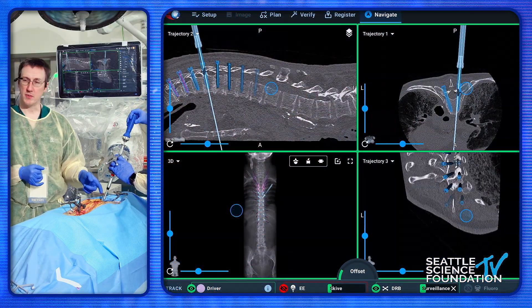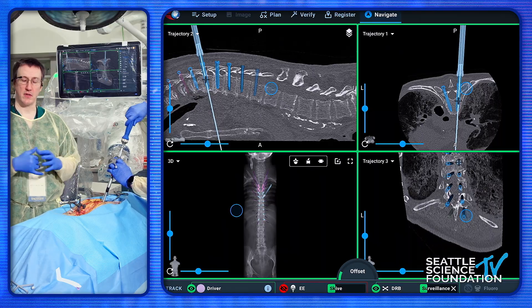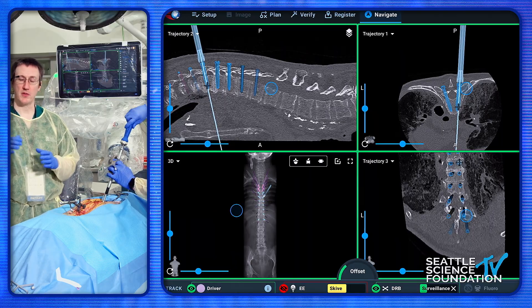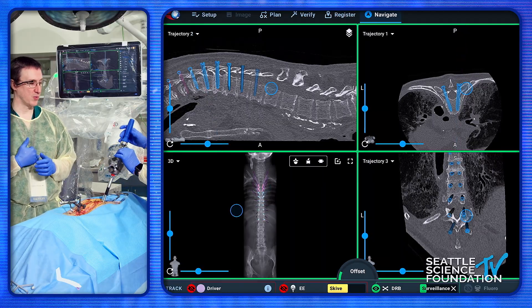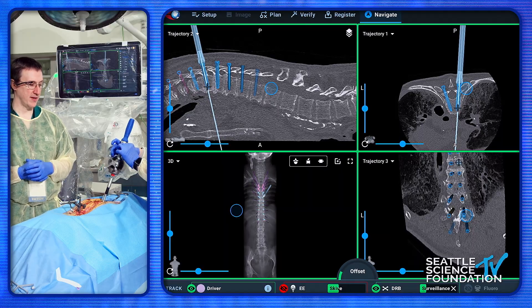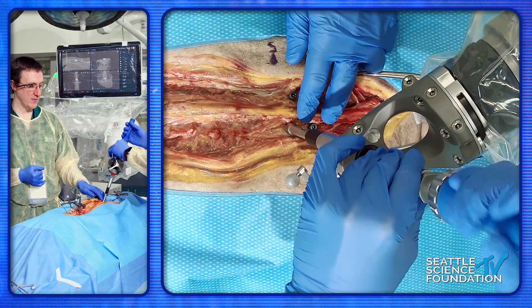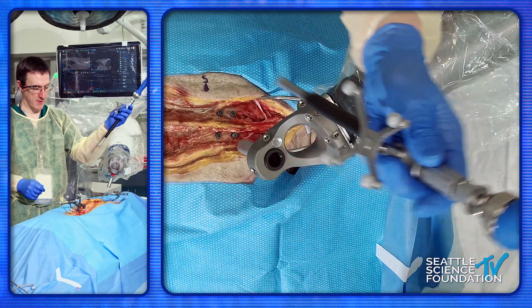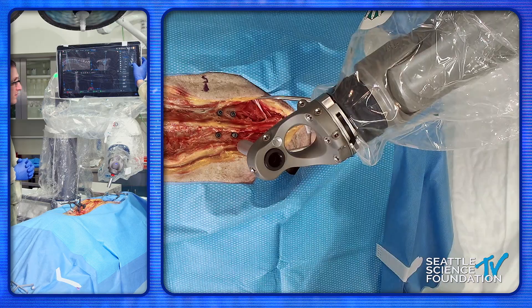These are the blunt tip screws — where he made the hole is where the screw is going to go. With redirections, if you have a revision case and that sort of thing, I agreed with the earlier speaker about tapping: you start with small taps and work yourself up, giving the screw the best chance of going down the hole you wanted. Checking with the ball tip feeler is a great way to confirm that. You might need a ball tip feeler that's a little bit longer to get past the sleeve, or you can enter from the side and back it up a little to take it out.